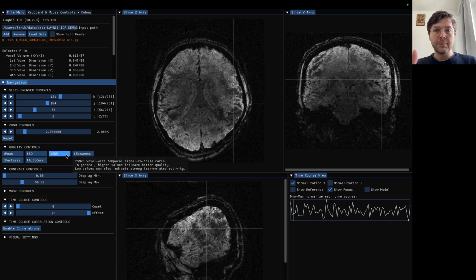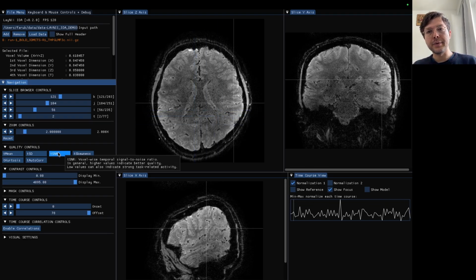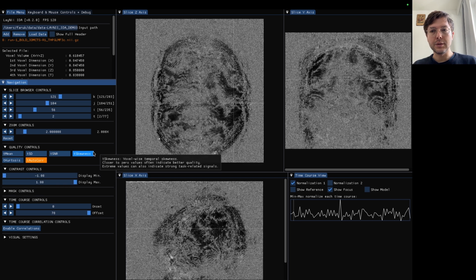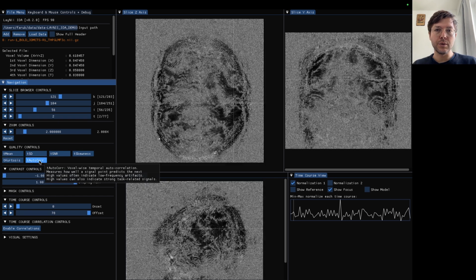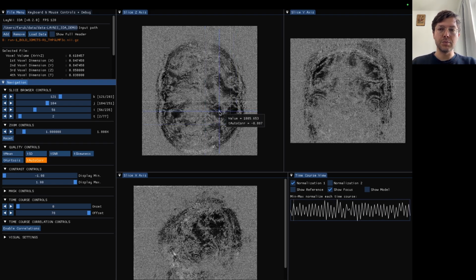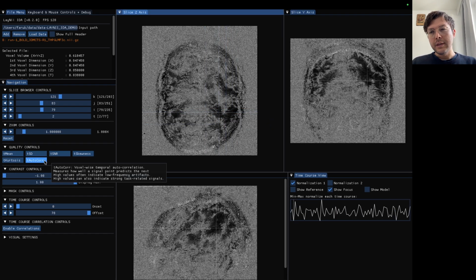So here, basically, I'm showing that what you can do is that you can plug in your fMRI data, and without running anything beforehand, just on the data itself, you can quickly switch between different quality control metrics like skewness, kurtosis, autocorrelation. We might expand it a bit more in the future, but I thought this was good enough for a new release of LayNii IDA.